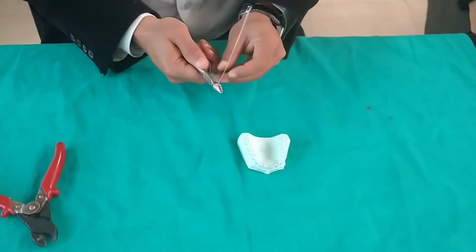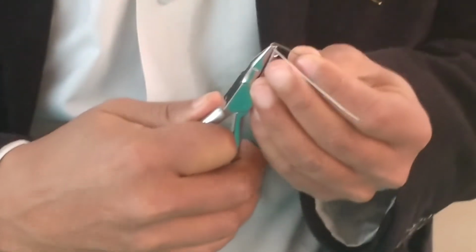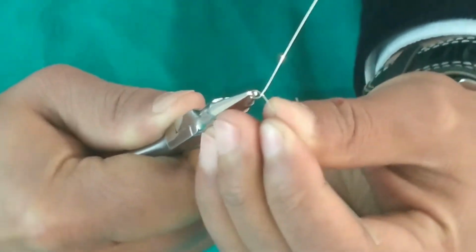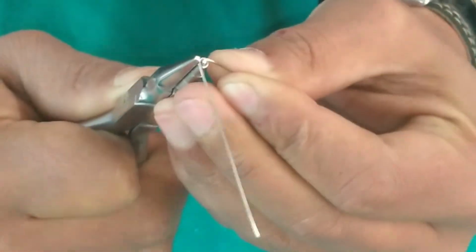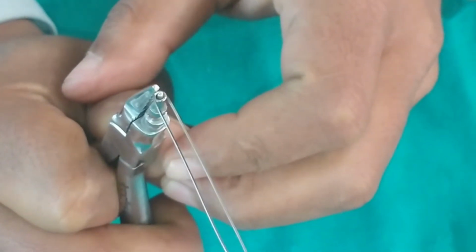Straightening the wire, 23 gauge or 0.6 mm wire, giving a helical loop. A helix is incorporated in the wire. Two turns are given, and both the arms of the helix are brought nearly parallel.